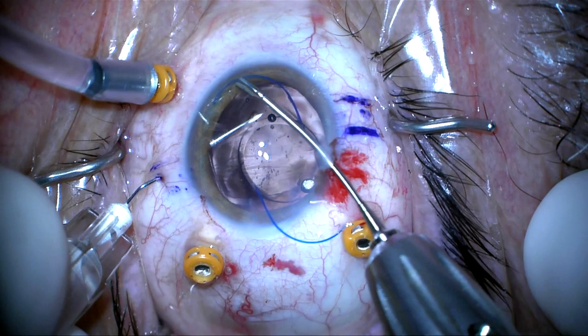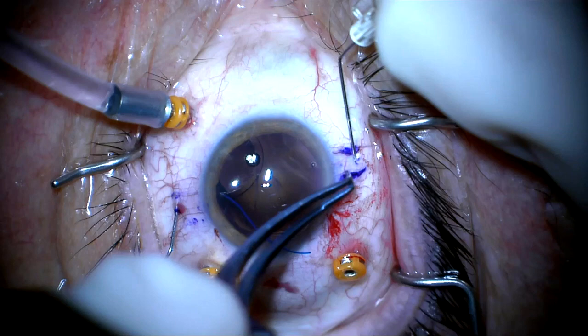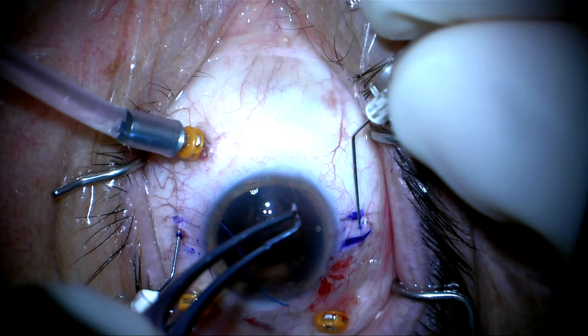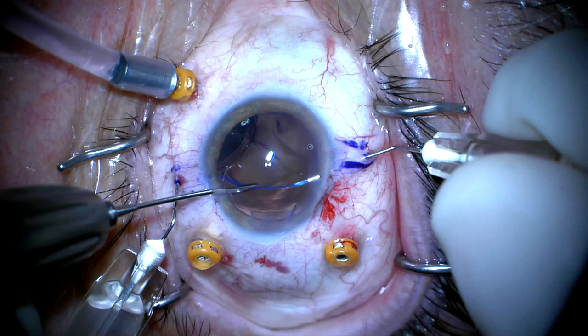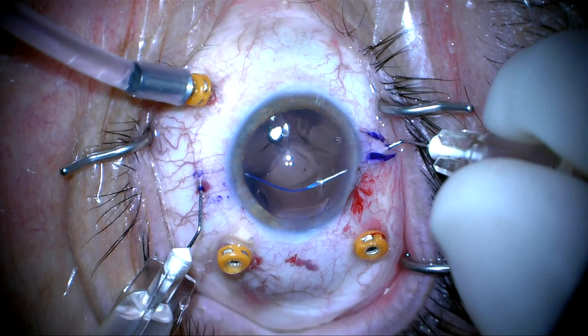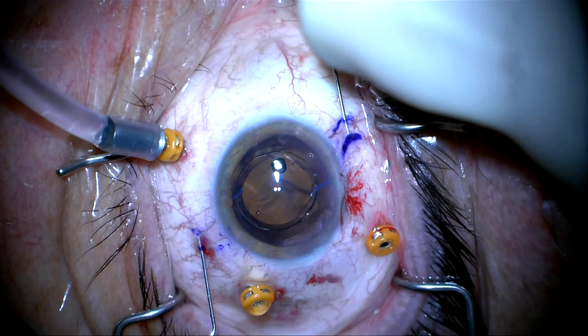We can now let go of the hub and do the other side. This is a 30-gauge needle and the tunnel is about one to one-and-a-half millimeters long. I'm going to use the tip of the needle to push the optic away so I can grab the haptic at the appropriate point for easy insertion into the 30-gauge needle. Both needles will be pulled out at the same time, which will rotate the lens. The needles are thin enough that they'll hold the haptic as I pull them out of the eye, and the haptics will come with the needle.